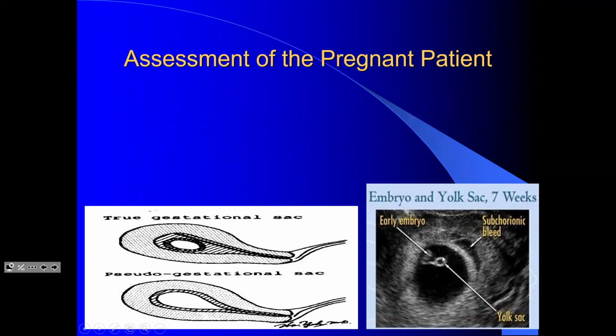As I've said, in the gestational sac, the first thing to look for is the yolk sac, which is a ring-like structure like this. To the side of the yolk sac, you would see a baby, which is the early fetus. We call this the fetal pole, or the embryo, an echogenic structure lying just adjacent to the yolk sac. Both more or less appear around 5 to 6 weeks of gestation.